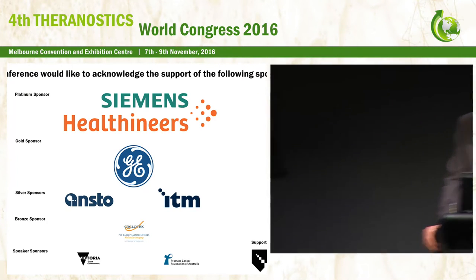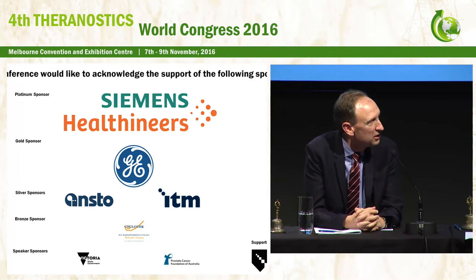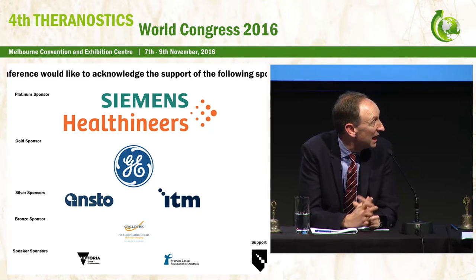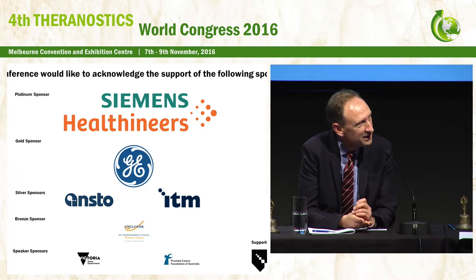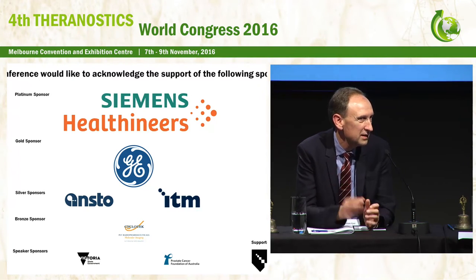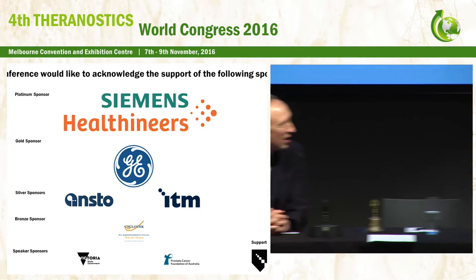I have one question for you, or one view into the future. As I see it, if we are very circumscribed, only looking at PRRT with lutetium-177, if we look a couple of years ahead and we accept that we need to do individual dosimetry, which is maybe not really proven. Do you rather think that we would do Q-SPECT on the first dose, or do you think that imaging ligands like copper-labeled somatostatin receptor ligands will, to do the pre-therapy dosimetry, be the ones winning this game?